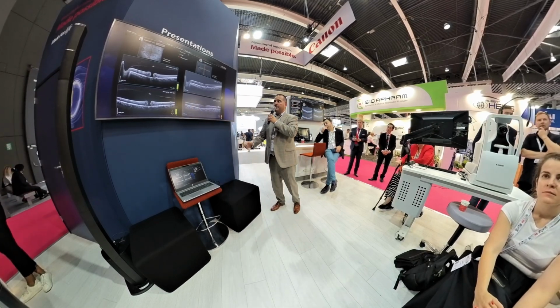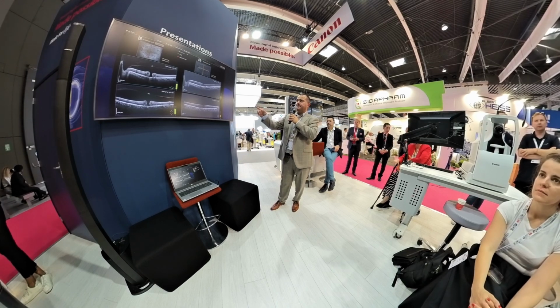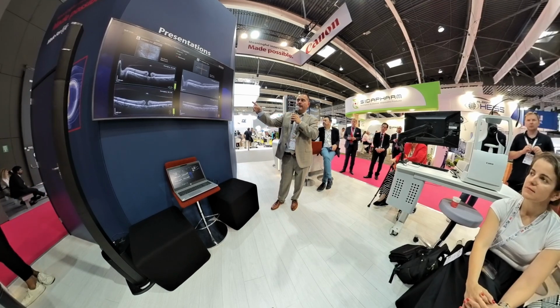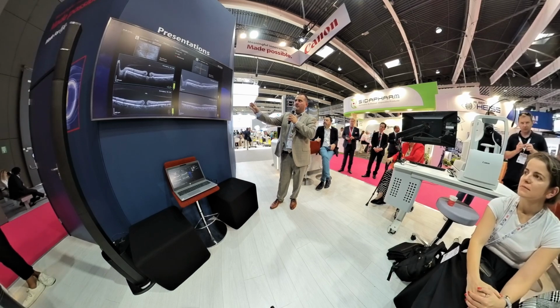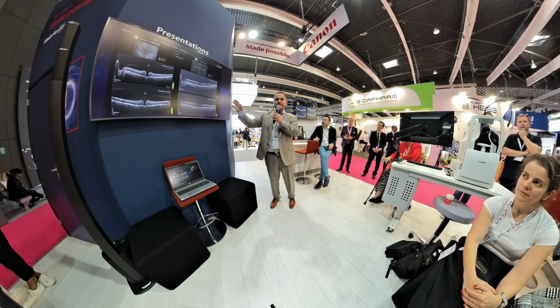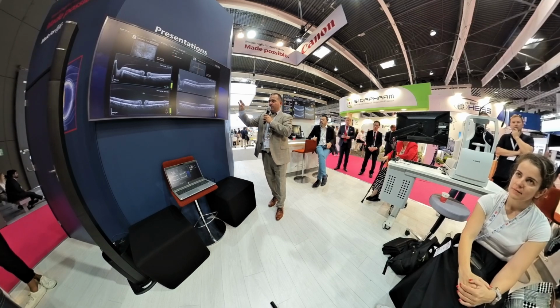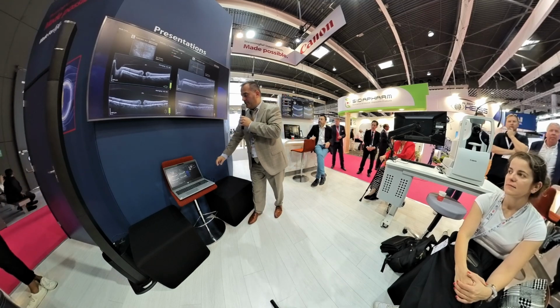Another case of full thickness macular hole with temporal ILM flap. I want to stress that the anatomy of the closure is really amazing. If you look only at the right images, you might not guess that there was a surgery in that eye. But again, when we have enough resolution, we can appreciate more the details of what we have done during the surgery.